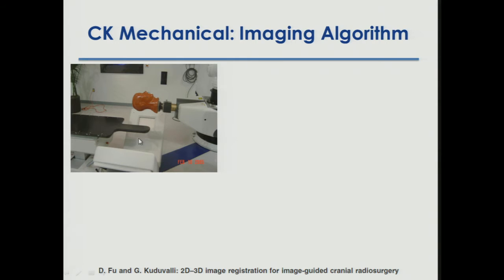And when you do CyberKnife commissioning, you actually see one of what I think are the most beautiful and elegant ways of QAing that imaging algorithm, which is taking an anthropomorphic phantom and mounting that on the tip of your robot, and you've already tested with the path alignment that your robot is an extremely accurate machine, 0.2 to 0.3 millimeters.